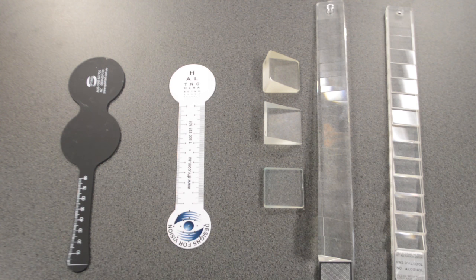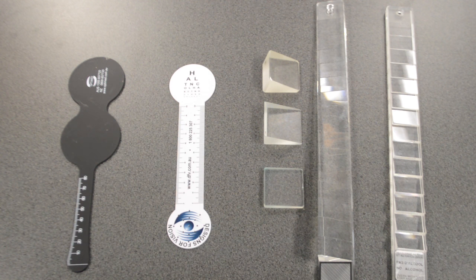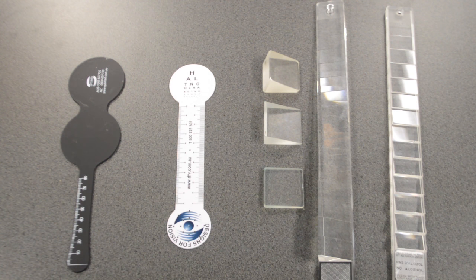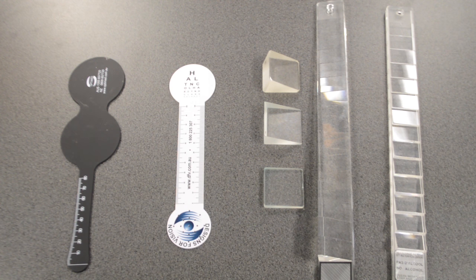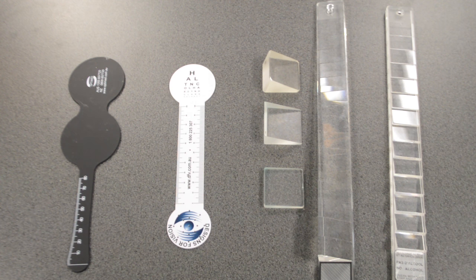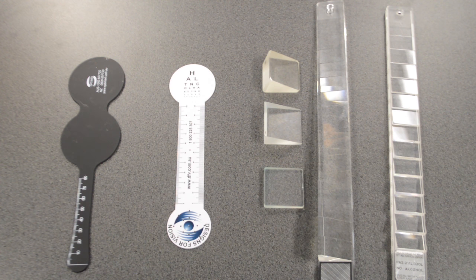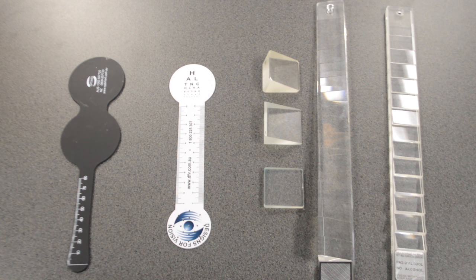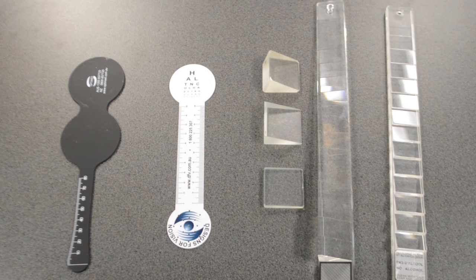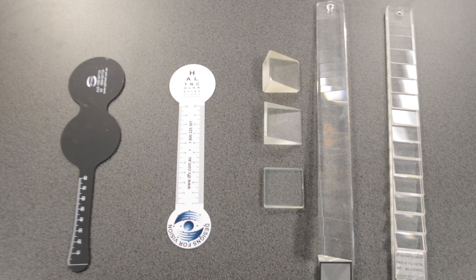These are the prisms that can be used to measure the size of the manifest or latent deviations. The horizontal bar is used for horizontal deviations, the vertical prism bar for vertical deviations. For this video we will be using a horizontal prism bar.